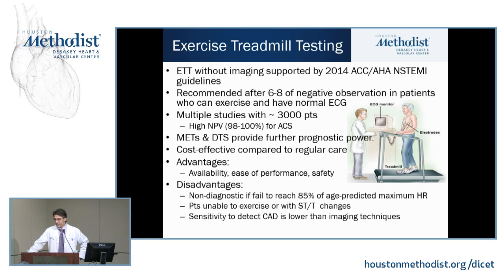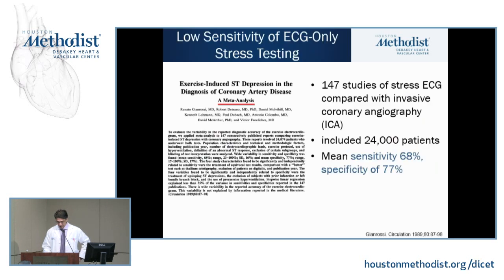Obviously, it has some disadvantages in this ED setting. You know that we have a lot of patients who are elderly, they've got hip problems, back problems, they may not be able to get on a treadmill. If they have any baseline EKG issues, an abnormal EKG already, that's further difficulty in your evaluation of a stress ECG. And then finally, it's great for prognosis, but we all know that it's not the best test for diagnosing CAD or detecting CAD.